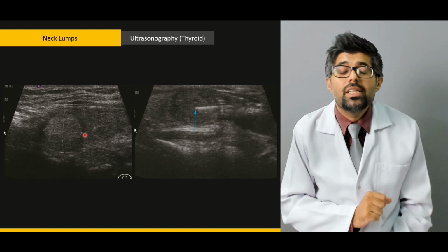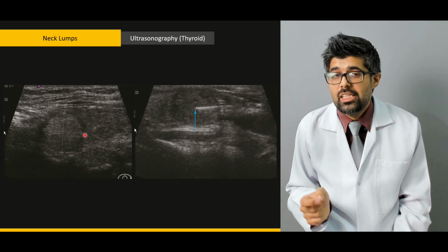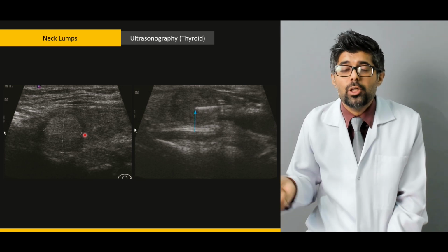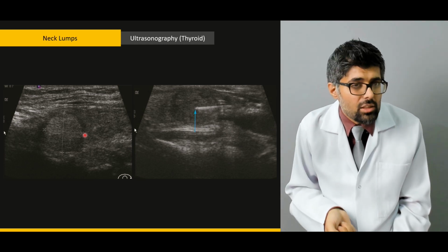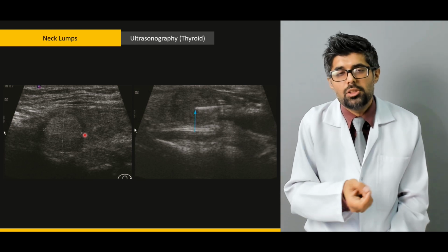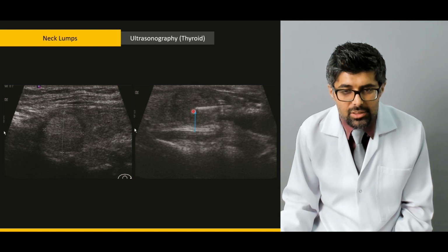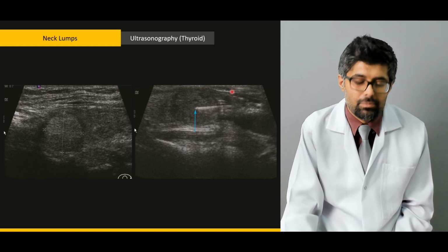Now, in order to investigate the nodules of thyroid origin, we perform an FNAC. FNAC stands for fine needle aspiration cytology. What we do is that we introduce a fine needle inside the nodule, aspirate some cells, maybe some tissue, and then investigate those tissues under the microscope. Here we have a thyroid nodule, and this is the fine needle that is piercing it for the cytology.